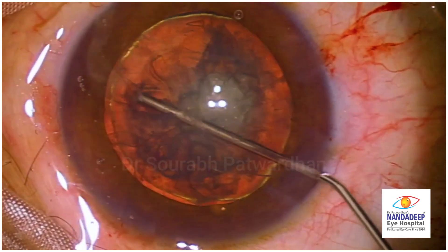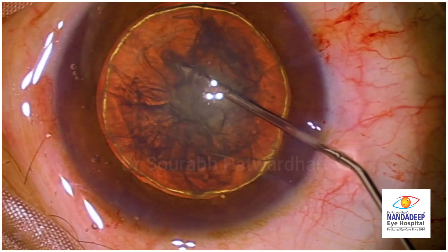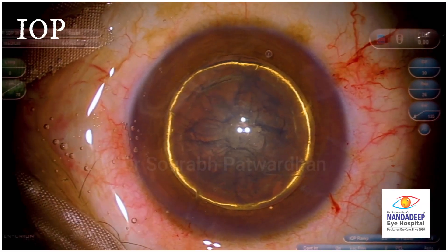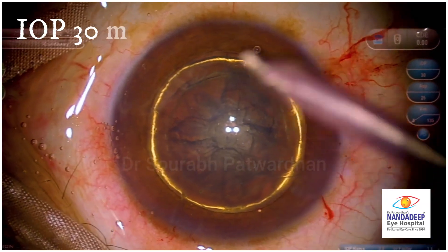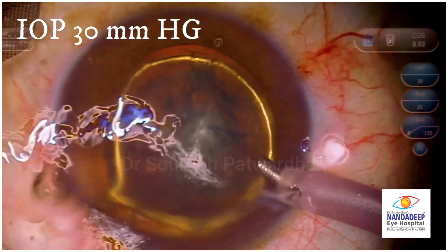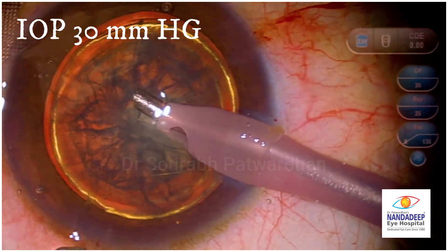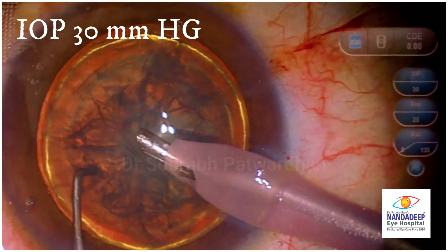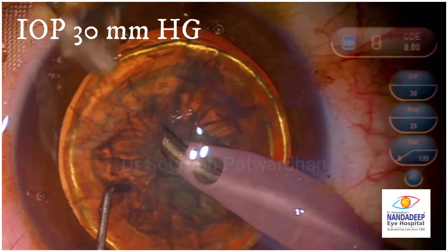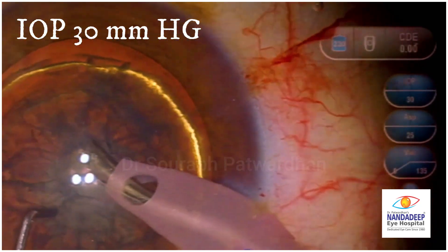Now here I am doing hydro delineation, carefully going into the substance of the nucleus. All throughout you have to make sure that the anterior chamber doesn't deepen as well as shallow during the procedure. Even during hydro delineation you have to make sure you don't inject too much fluid into the nucleus.